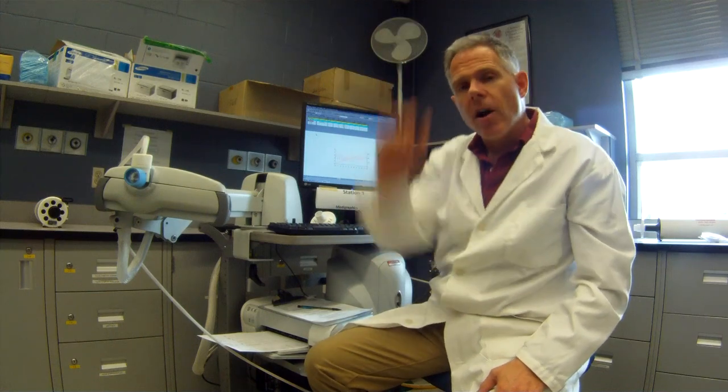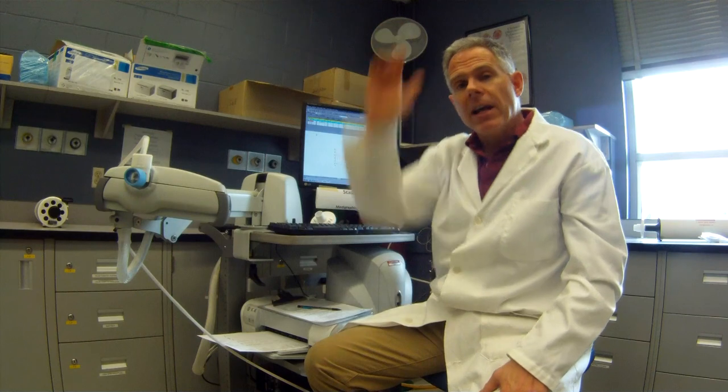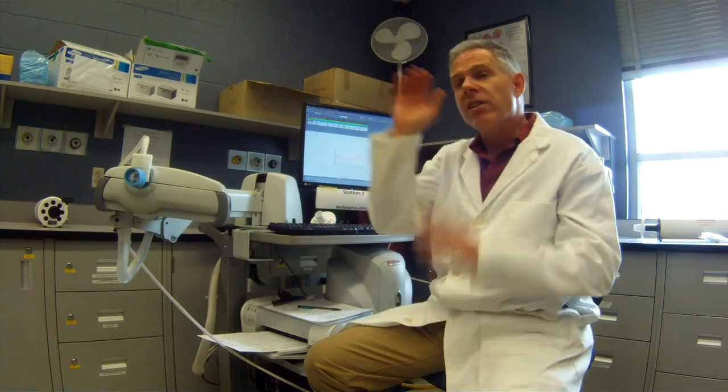Breathe in hard and fast, keep going, hard and fast. We'll start the timer, and we get them blowing hard and fast for the entire 12 seconds, okay? It's important to coach vigorously and not let the patient slow down or back off, to keep good vigorous effort for at least 12 seconds, all right? So let's see what that test looks like. And that is an MVV, or a maximal voluntary ventilation, all right?